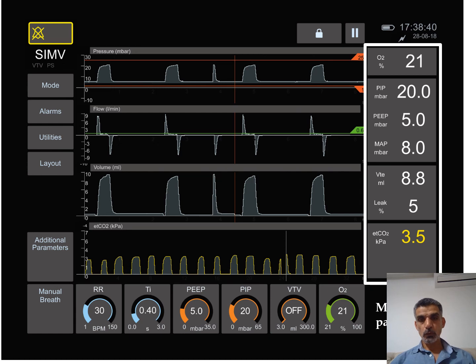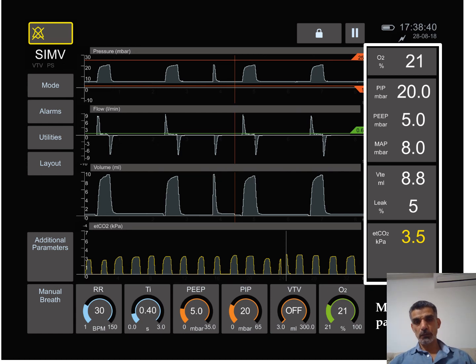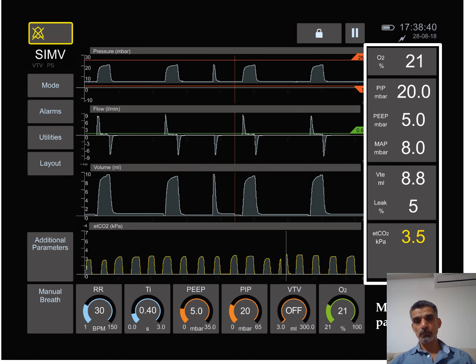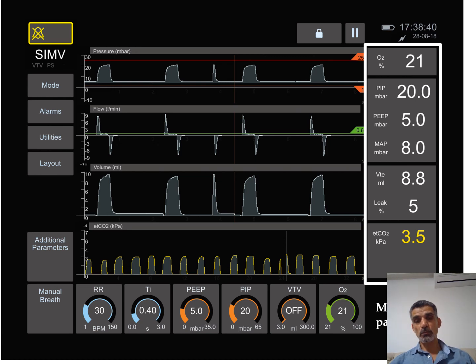We also see a number of numbers in sidebars and this is not what we set, but what is measured by the ventilator. So we set 21 percent of O2, but this tells us how much actually oxygen is going to the baby.